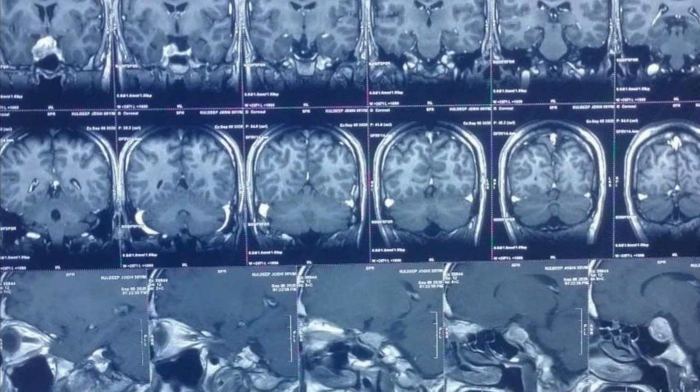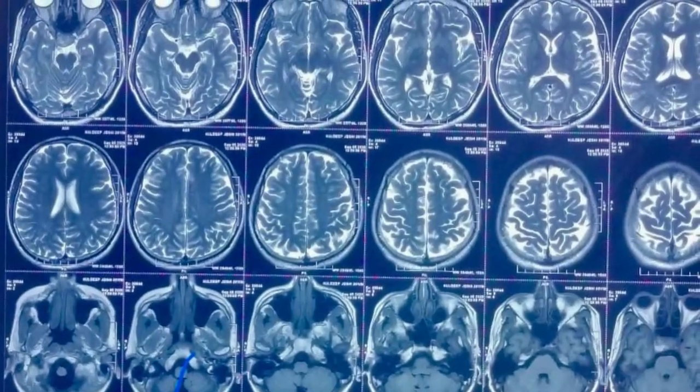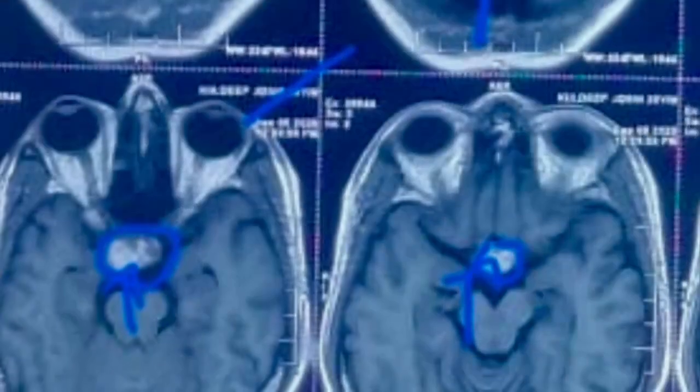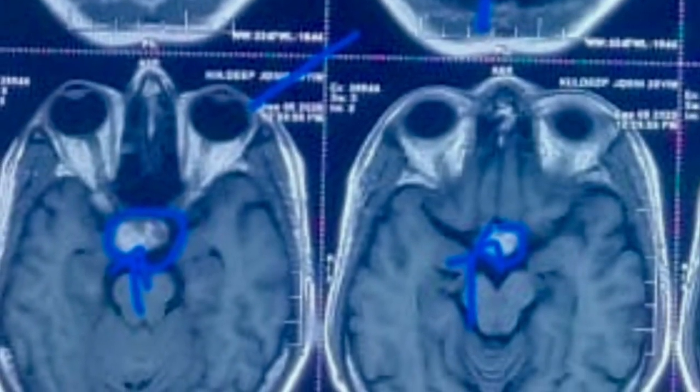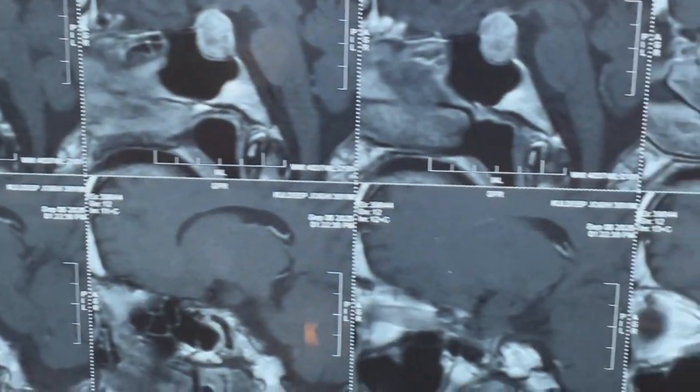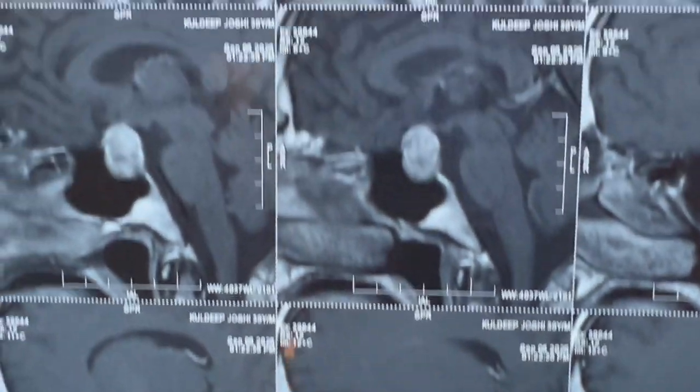There is heterogeneous signal intensity with an area of hemorrhage on the right superior part of the pituitary region. There is compression of the optic chiasm and extension of this tumor into the right cavernous sinus. On T1 MRI, the lesion shows hyperintensity in the pituitary area. It is suggestive of pituitary hemorrhage, which is called pituitary apoplexy.